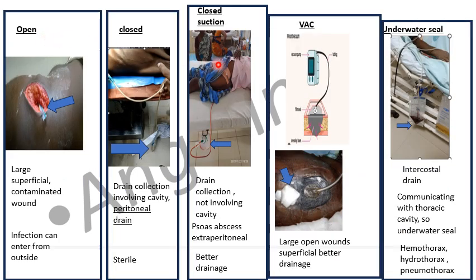So now please don't rush through the images. Stay with me. I'll take you there in a very systematic way. So what about these open drains? You can see the drain here. It's kept for a large superficial contaminated wound.